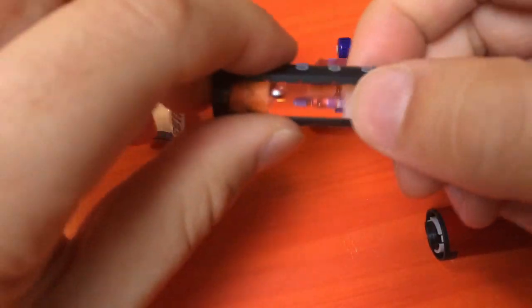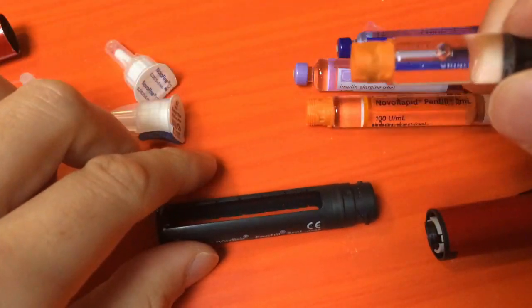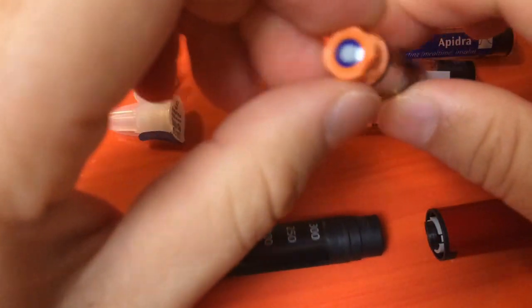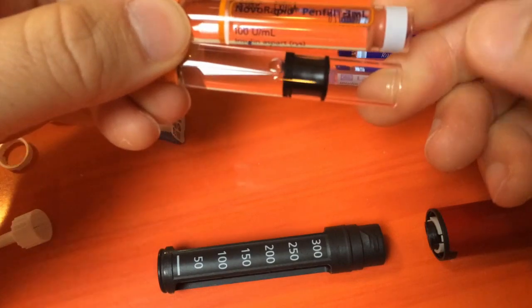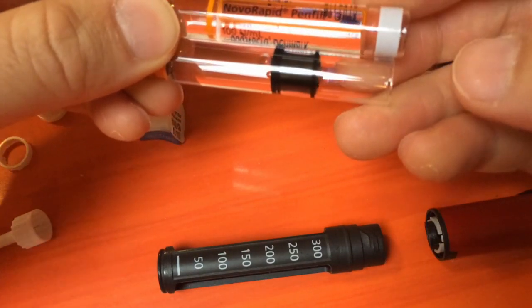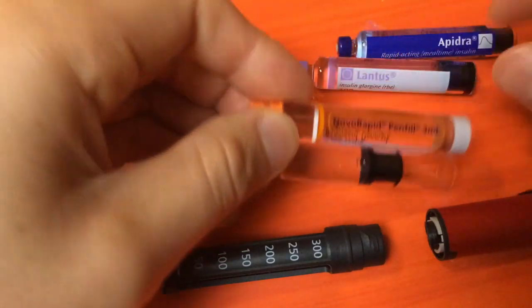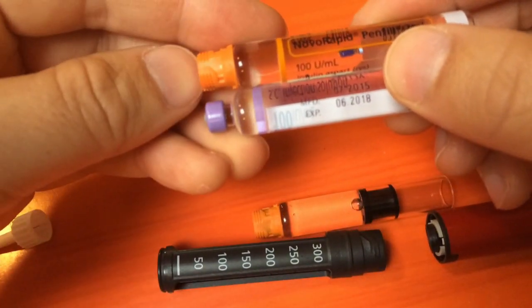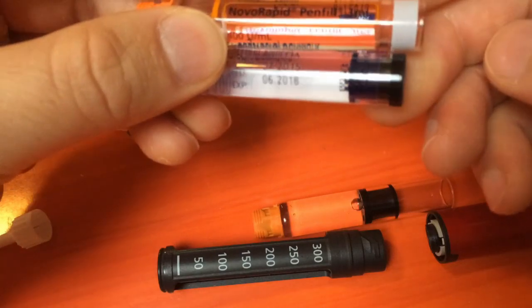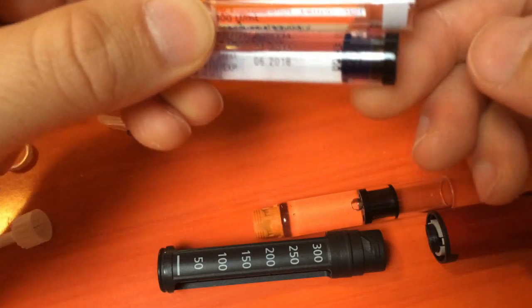This one is an Apidra vial. As you can see, the difference in size is what makes it not work. It's slightly shorter, and the same with Lantus. When lined up on one end, it's about 2-3mm shorter on the other end.